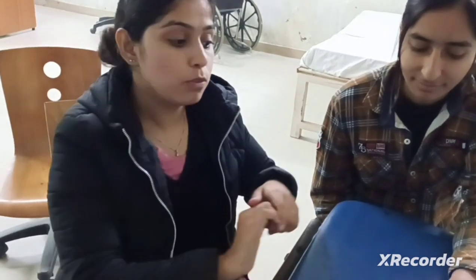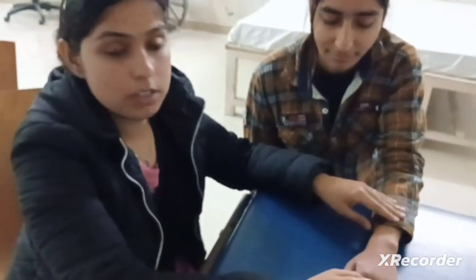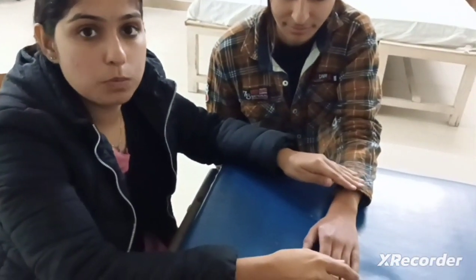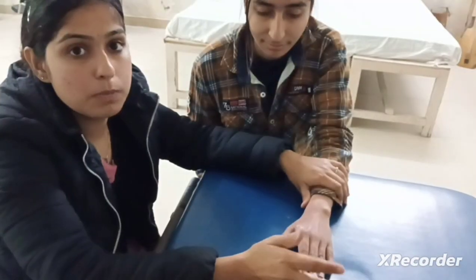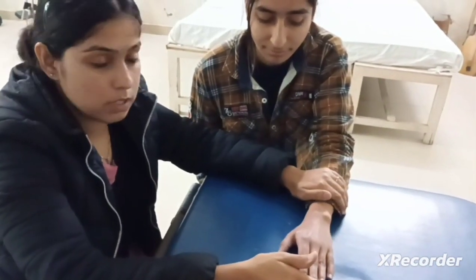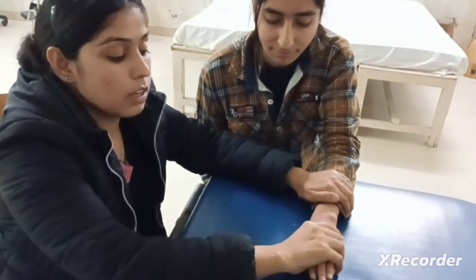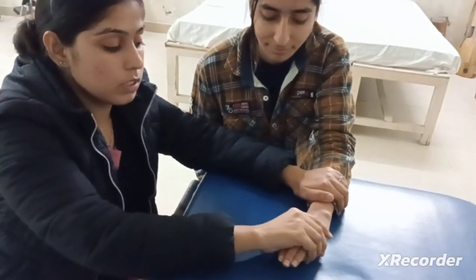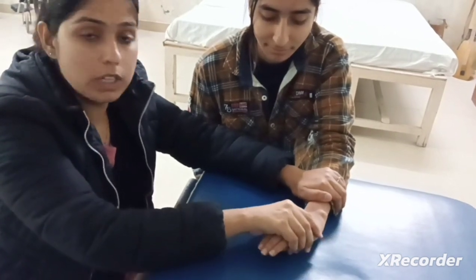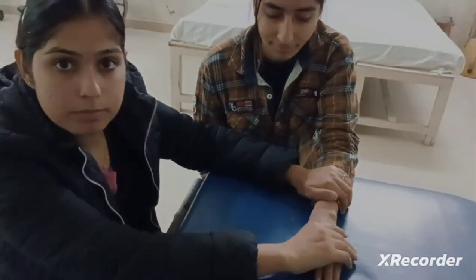Okay, so now I will show you the wrist radial deviation goniometry. Before checking the wrist radial deviation goniometry, first we will check the range of motion of the wrist radial deviation. For the wrist passive range of motion, the elbow should be stable, place the hand in your hand, and move the hand toward the thumb. So this is the radial deviation of the wrist joint.